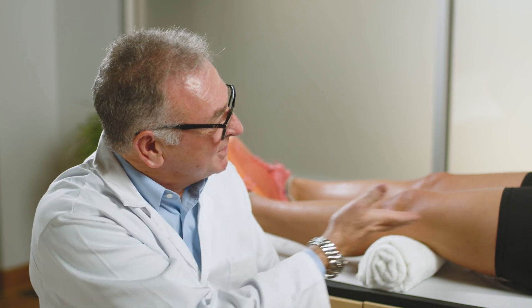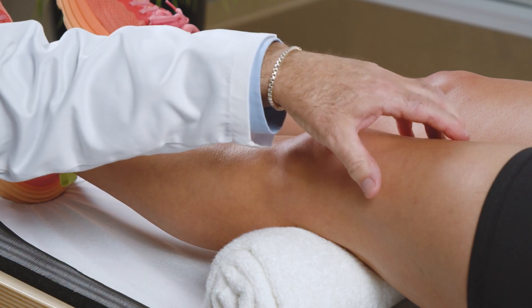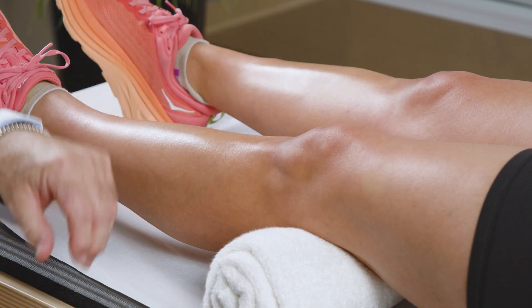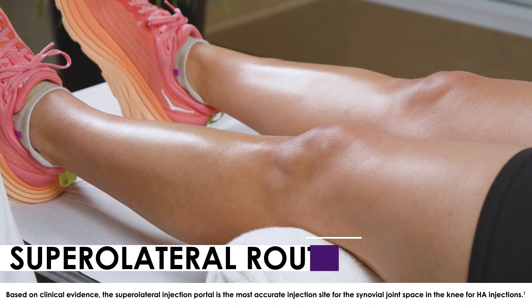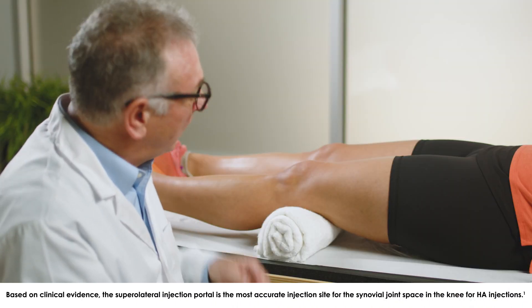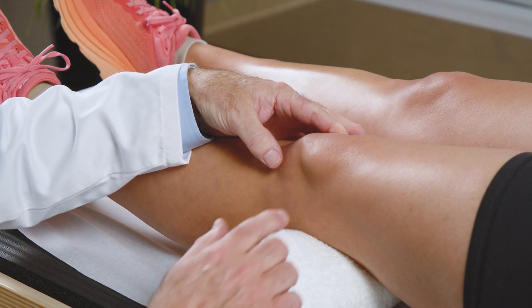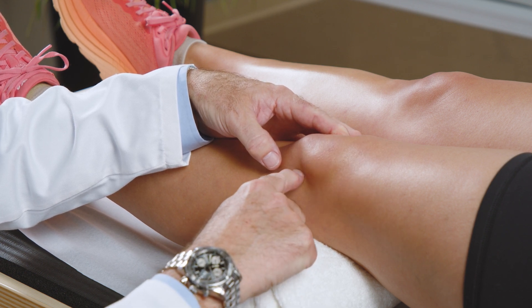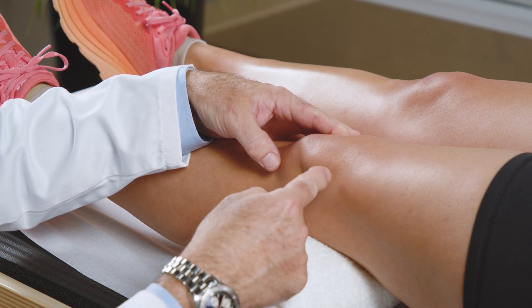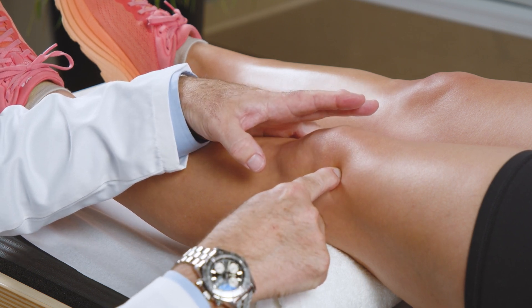The second position we're going to demonstrate is with the patient in a supine position. Typically we would roll up a towel to support the knee so that the quadriceps are nice and relaxed and it's easier to identify the landmarks necessary for the supralateral route of injection. In order to do that we identify the patella, and if you sublux it laterally and then draw a line across the top of the patella and then up the lateral aspect of the patella, where those two lines meet — just make a little mark — and that is the place that you will be doing the injection.